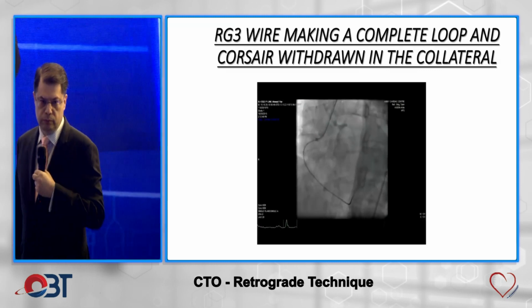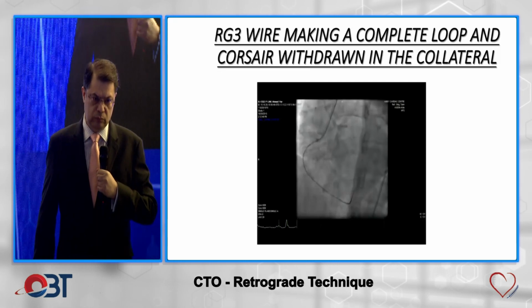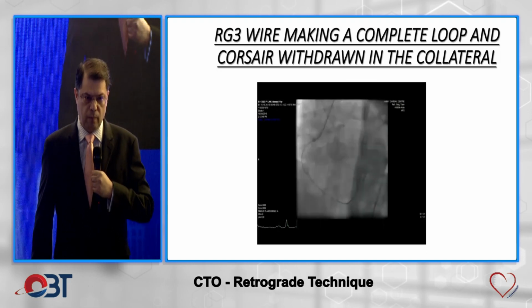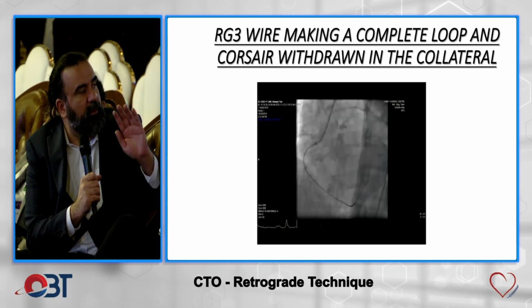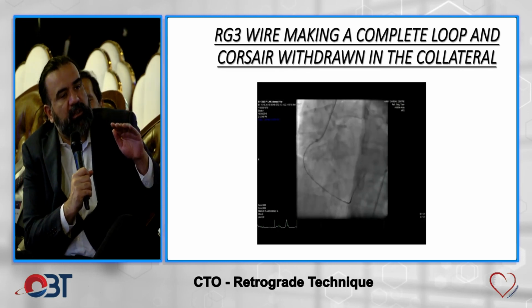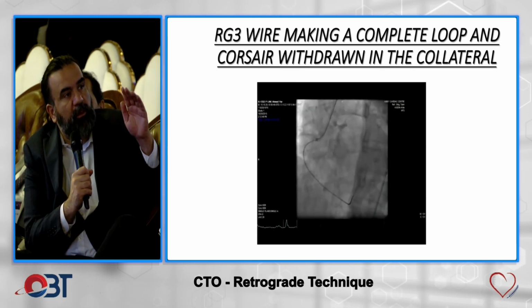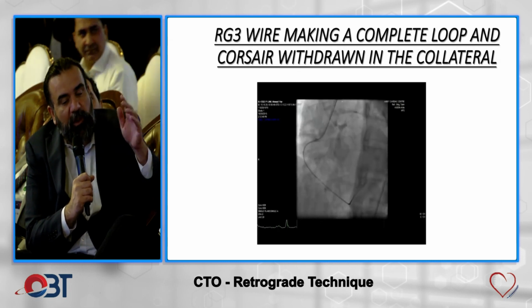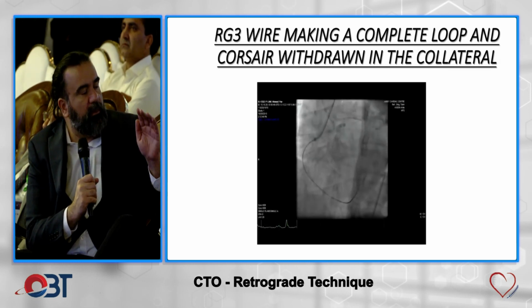Okay. So this is a very important question. और उसका जवाब ये है कि it takes time, right? So ये 15 minute, 20 minute, आधा घंटा, this is for experts. These are the people who do this day and night, right? When you're starting off CTOs, those time limits don't apply to you. When we started doing our CTOs, मेरा पहला जो proctored case था was 4.5 hours. उसके बाद कम हुए, फिर एक case हमारा शुरू में was 6 hours long. Because my proctor didn't want to give up, I gave up, he didn't want me to give up. So when you start doing CTOs, the cases can take a long time.